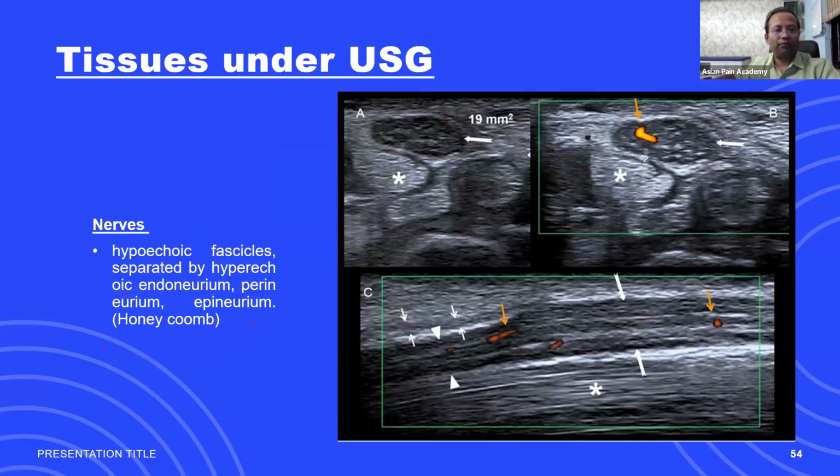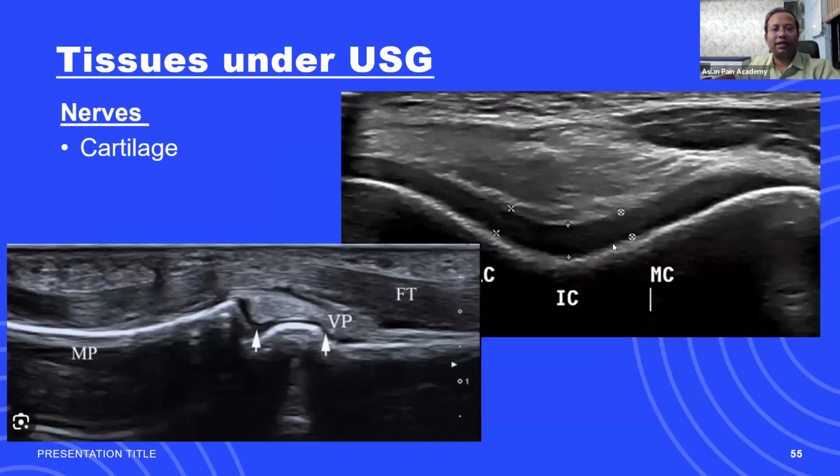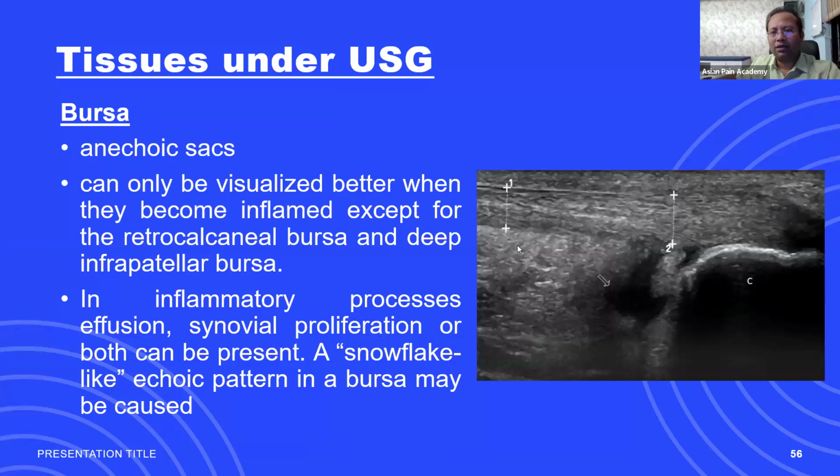So this one I will show you. You just try to remember cartilage. Cartilage is again an anechoic structure. Here the complete ultrasound is absorbed, there is no reflection from the tissue, no resistance, no impedance. That's why it is completely anechoic. Nerves, cartilage. Okay.